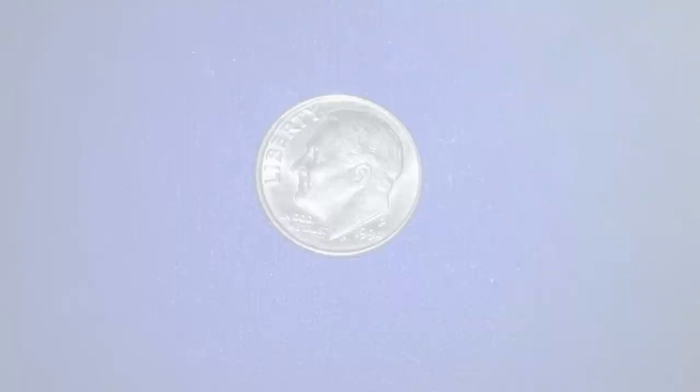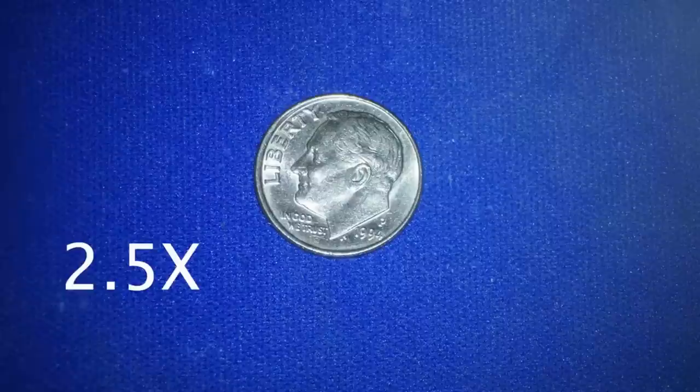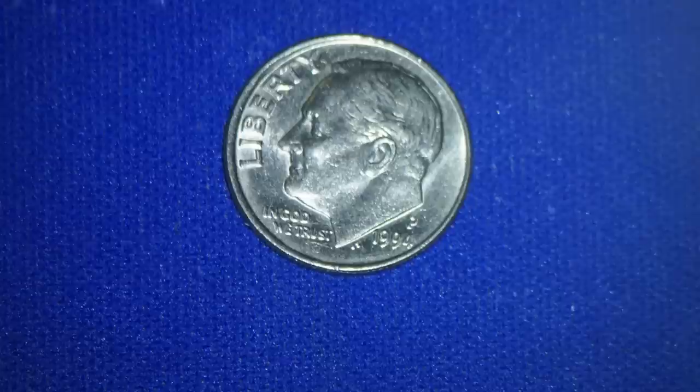Let me give you an example here. A dime is about 20% larger than our largest molar. This is a view at 2.5x like you would see through loops. If the person is using 3.5x loops, you would get a slightly bigger size.